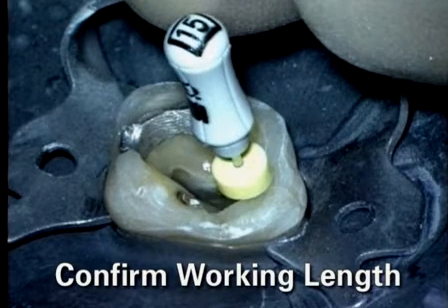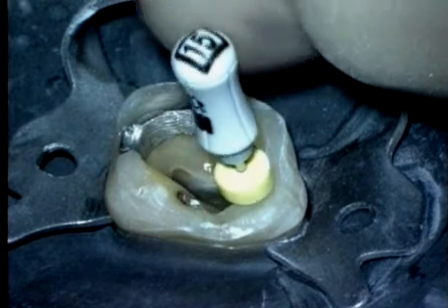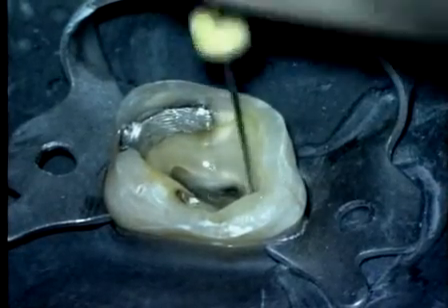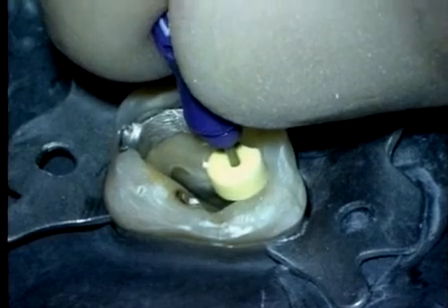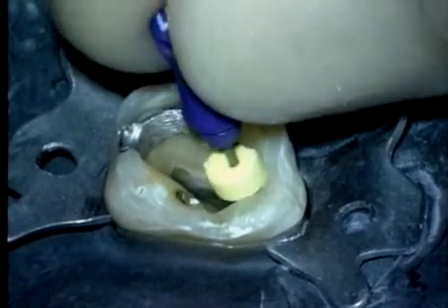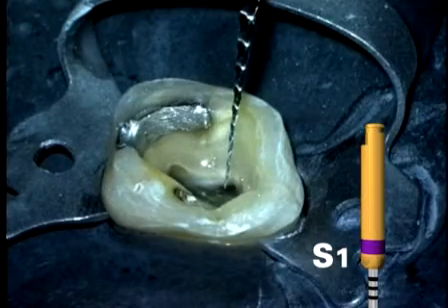After confirming working length, it's time to irrigate and fill the chamber brim full with sodium hypochlorite. The 10 file is passed through the canal, and we maintain patency. Little short amplitude strokes ensure patency, and progressively longer strokes confirm the glide path. We're now ready for the use of Shaper number 1.